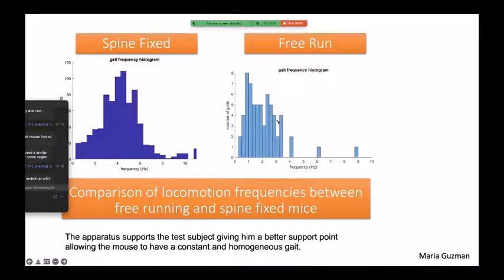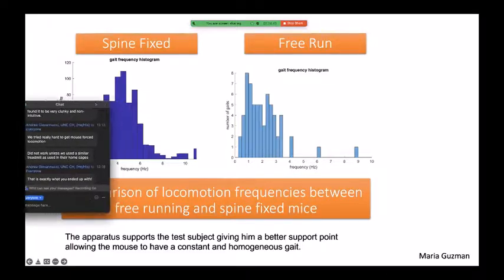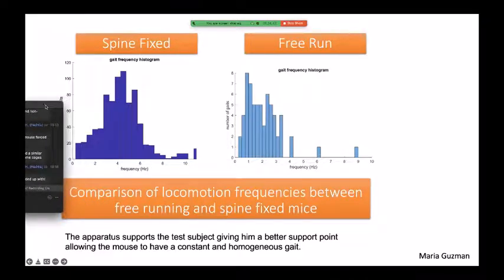But I think in the end, having the mice run comfortably is the best thing, because when we initially tried this preparation, sometimes the mice would just sit there and not do anything, and we'd be running the laser over the imaging spot and it would just burn after a while. So we needed a way to have the mice first run over a motorized treadmill, and now where we're at, having the mice run voluntarily.